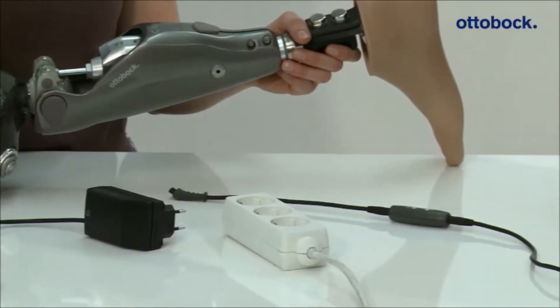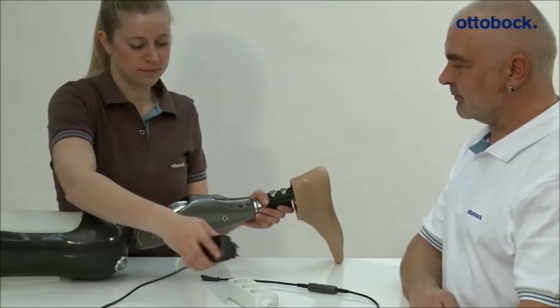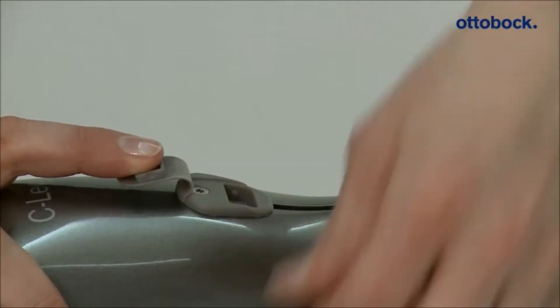After connecting the charger, the knee joint emits a beep signal and shortly after that a three times vibration signal. If there are no feedback signals, the joint is not charged. In this case, check if the charger was connected correctly.